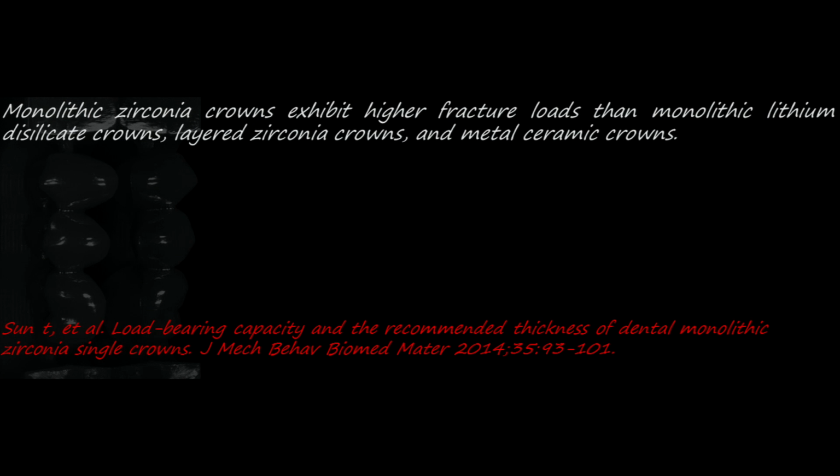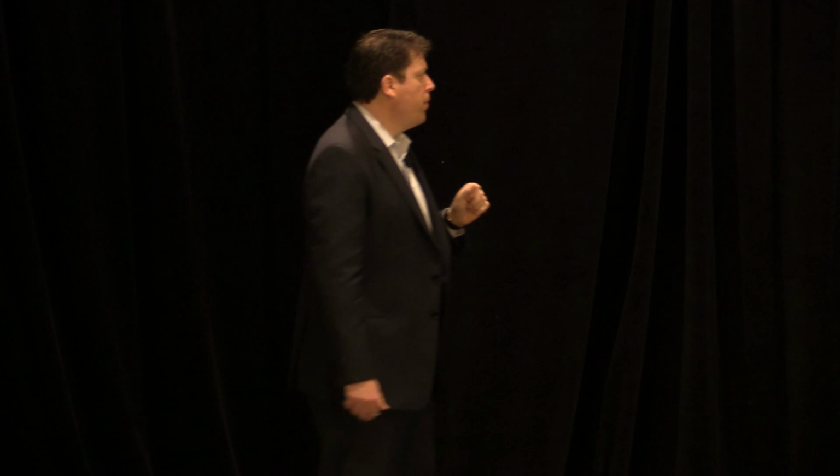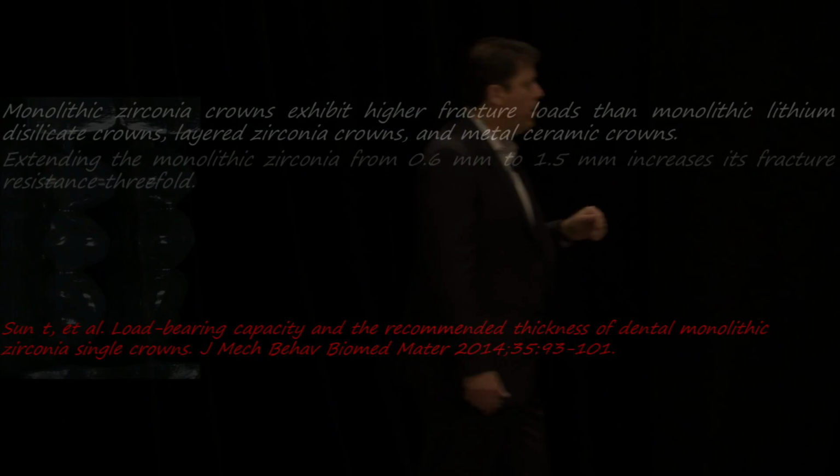What else is important to remember? Well, here's the thing. This is a new study that just came out towards the end of 2014, and that study looked for the first time at how zirconia behaves as compared to PFM, to metal ceramic restorations. So monolithic zirconia exhibited significantly higher fracture loads as compared to monolithic lithium disilicate, layered zirconia, and metal ceramic restorations.